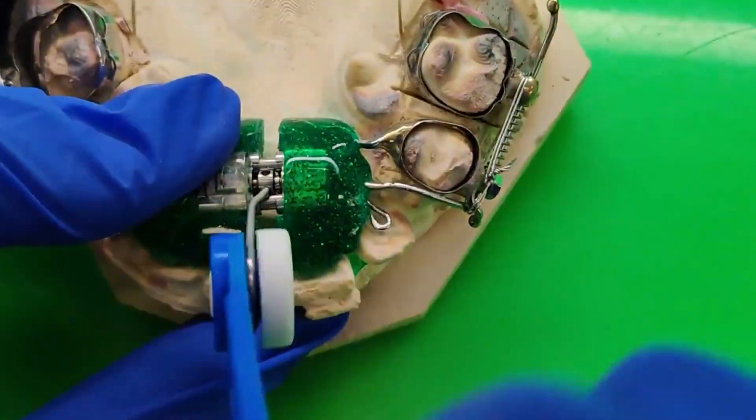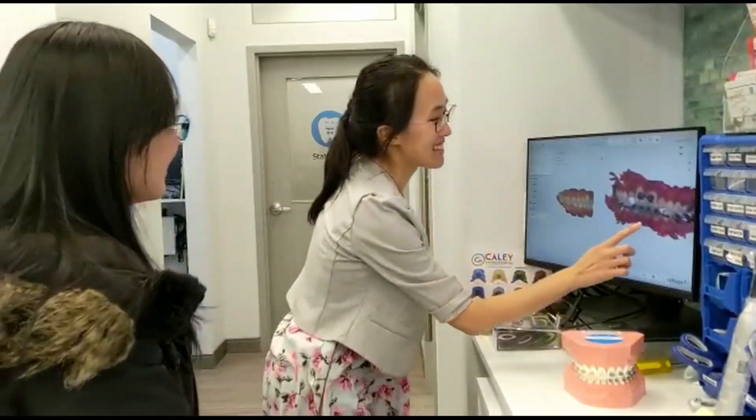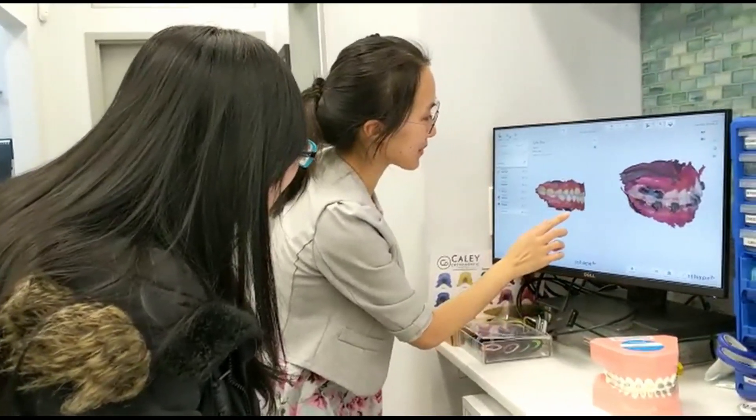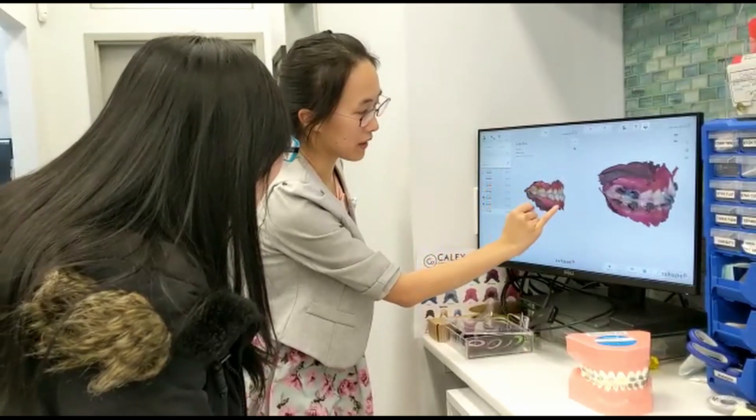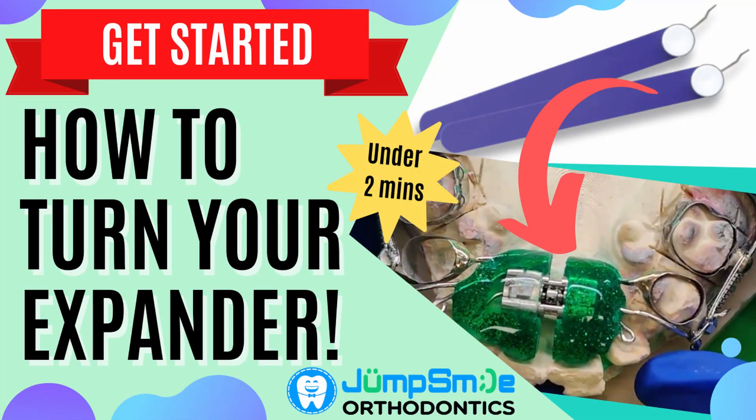Some expander designs require parents to adjust at home every few days. Parents can feel very nervous hearing about it, but it's actually not that difficult once you understand how it works. In today's video, we'll show you exactly how to do it. Let's get started.